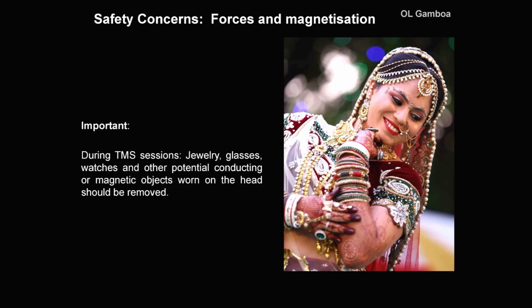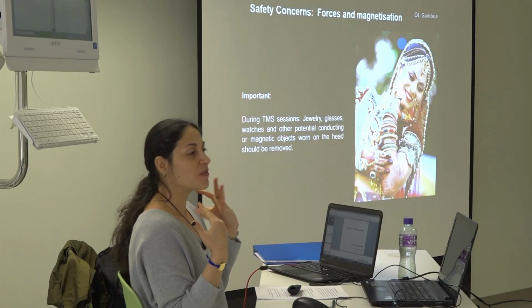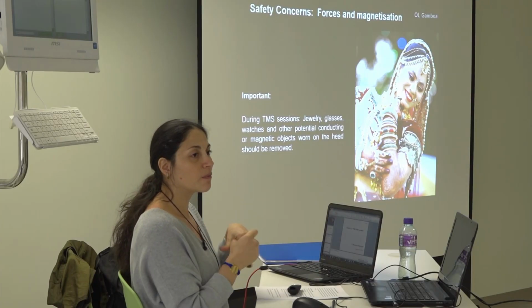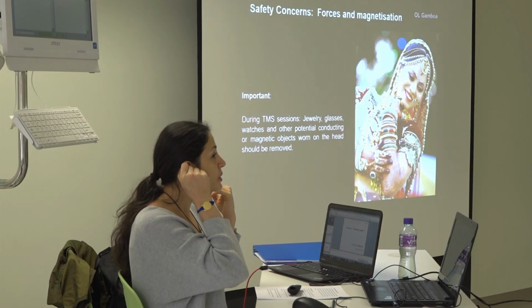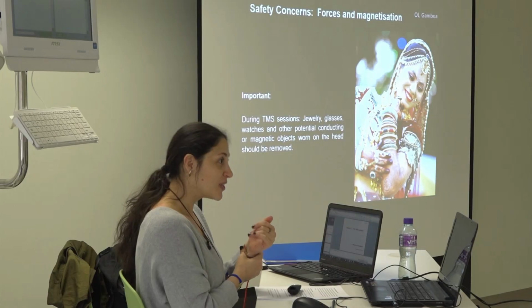This is very important, at least in what I think. When I'm doing TMS, I ask the person to remove all the jewelry or everything that they have. I know some people that don't mind, for example with piercings. I don't do it. The safety guidelines say you should not do it. The manuals of the machines say you should not do it. So don't do it.